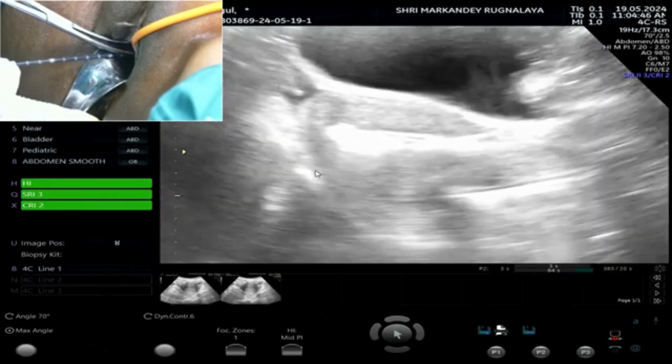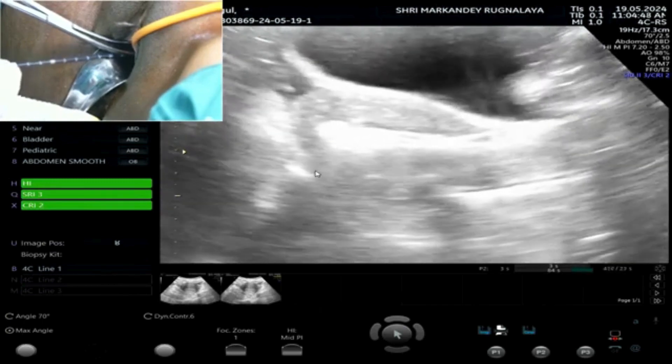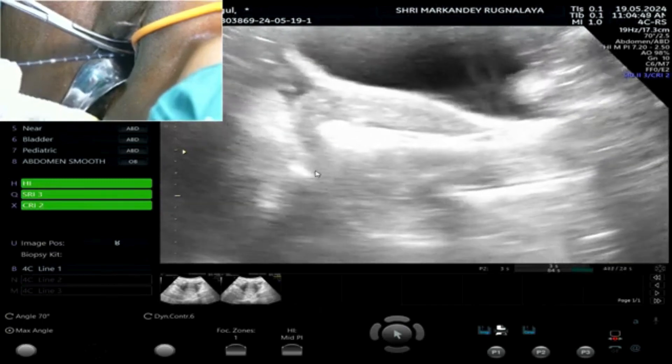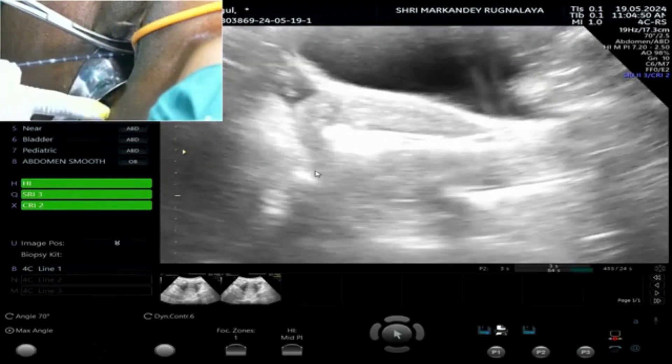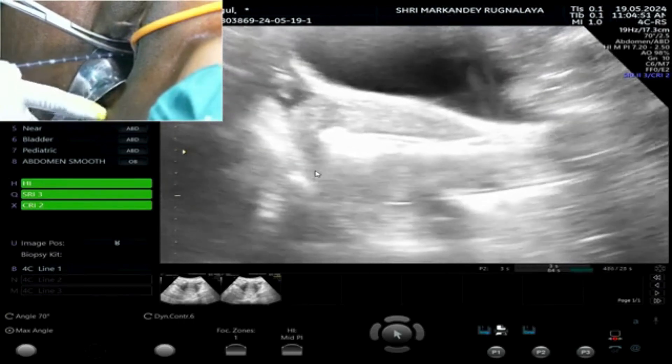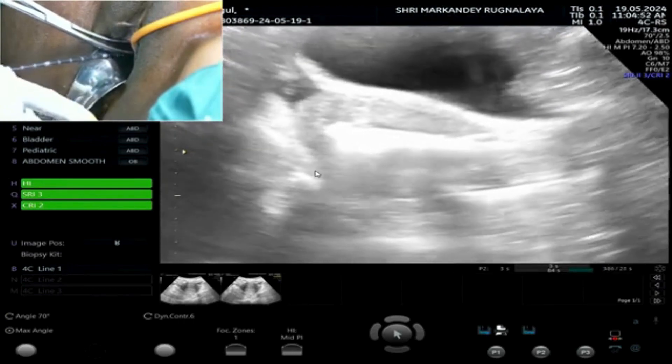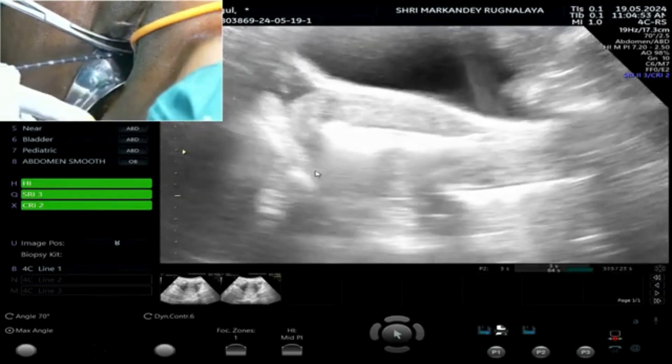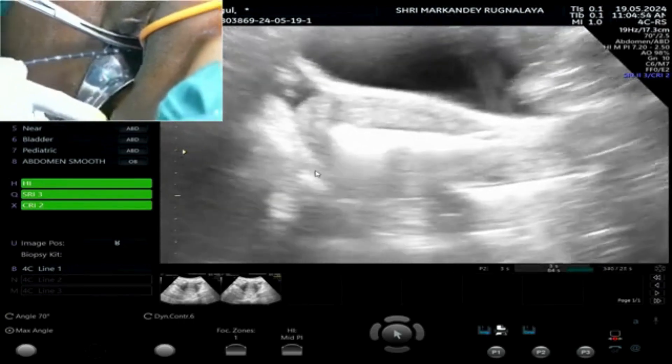It coagulates the spiral arteries. You know, spiral arteries — then only the bleeding will be controlled. You can see.